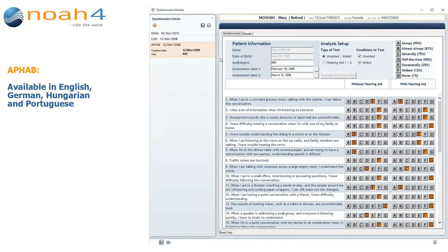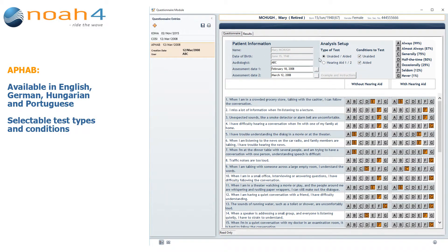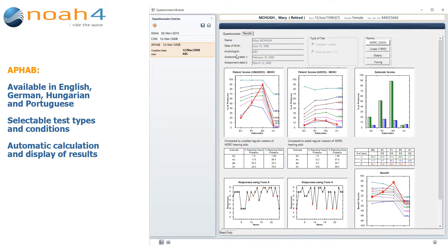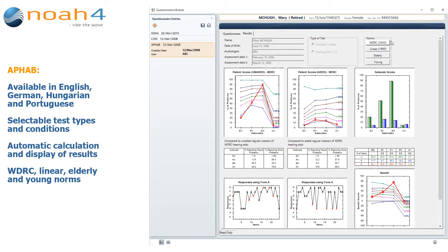The APHAB questionnaire is available in English, German, Hungarian, and Portuguese. APHAB offers selectable test types and conditions, the automatic calculation and display of results, and WDRC, Linear, Elderly, and Young norms.